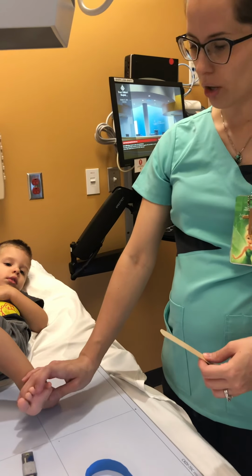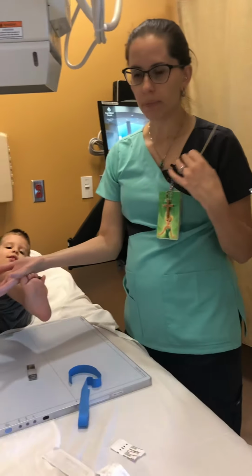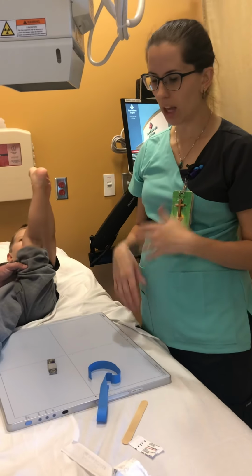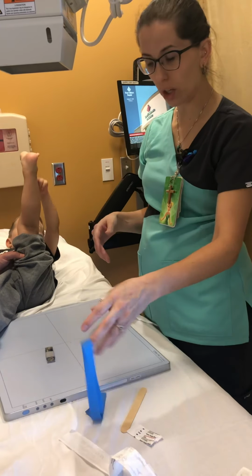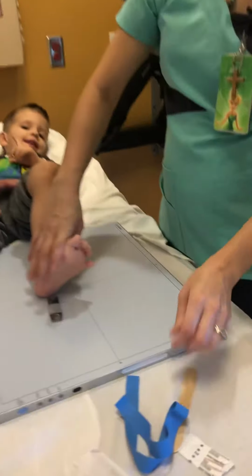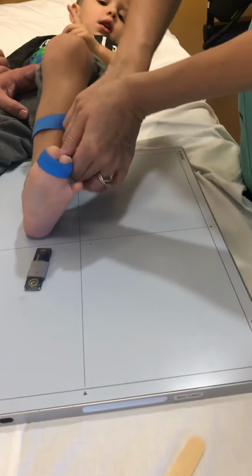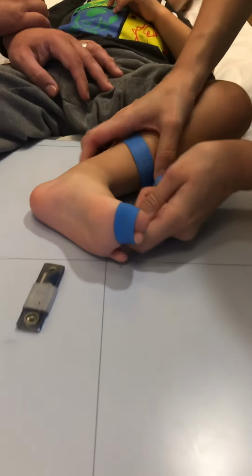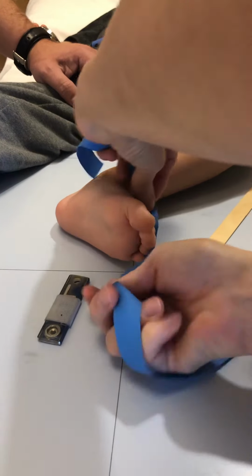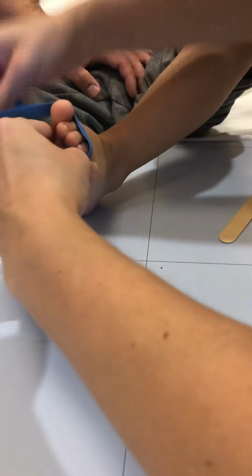If it's the middle toe, good luck, that's in the middle. You can go midline, or you can turn them medially, or you can turn them laterally. It doesn't matter. It's still going to have angulation, or not angulation, but magnification on it. And if it's the fourth and fifth toes, you'd go laterally, and again, trying to retract the toes as best you can. Turn them to the inside, and you may have to use a combination of things. I've had so many different contraptions worked up so that I can get toe x-rays appropriately.